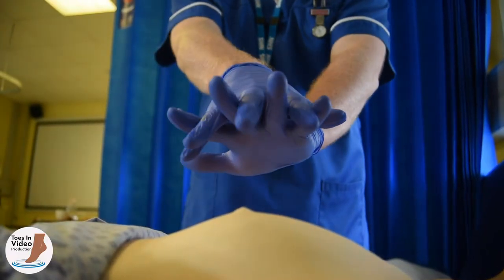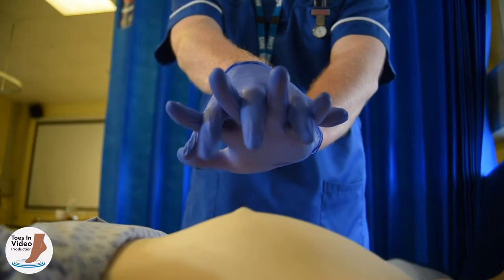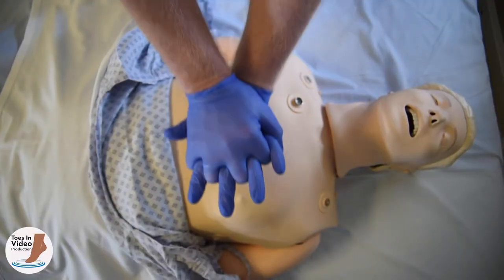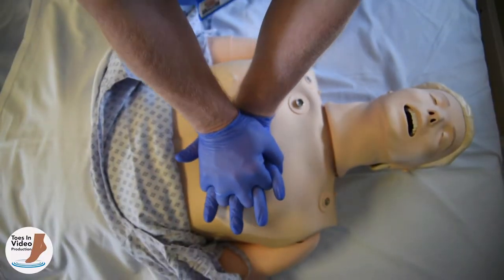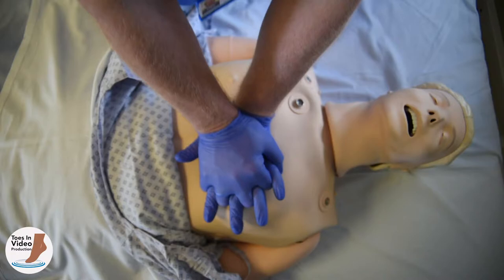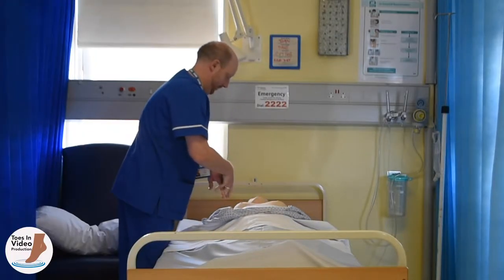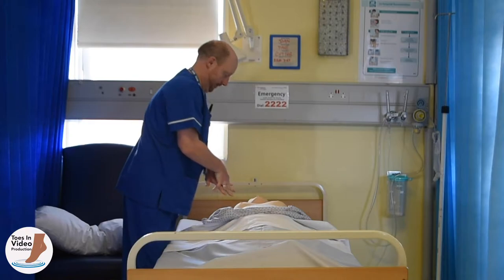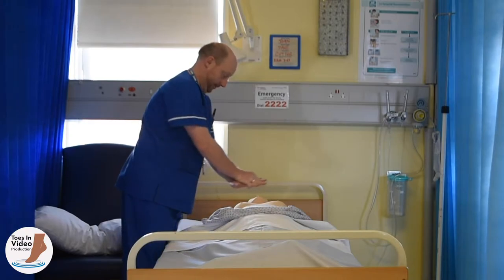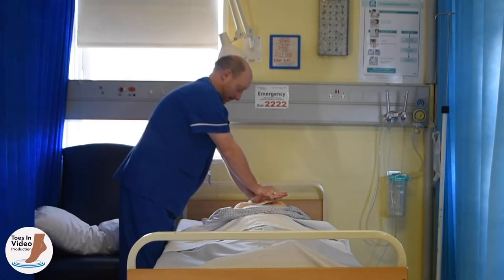Place one hand on top of the other, whichever way feels most natural. Interlink your fingers and place the heel of the bottom hand in the centre of the chest — this should be the only part of your hand in contact with the chest to minimise trauma. Positioned at 90 degrees to the patient's side, bring your shoulders vertically over the centre of the patient's chest, ensuring that your shoulders are vertically over your hands and that your elbows are rigid.